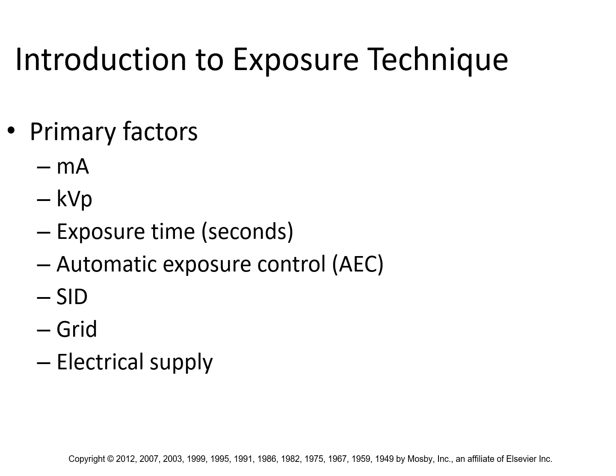It's actually inversely proportional to the square of the distance. It's called the inverse square law, because as distance increases, the intensity reduces by the square of the inverse of the distance. Okay, I will run through the mathematics of that with you in physics class.